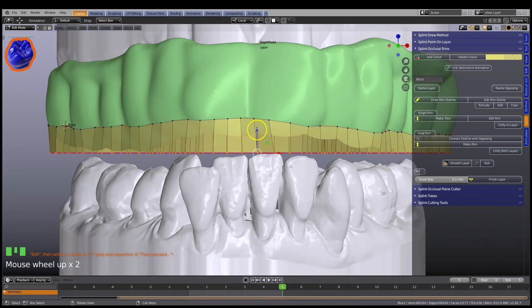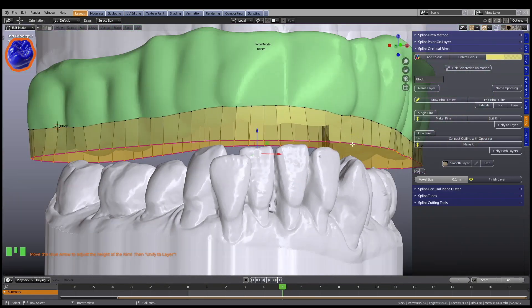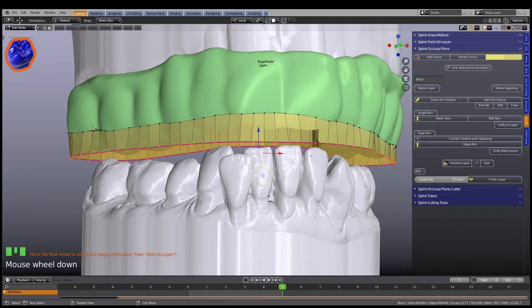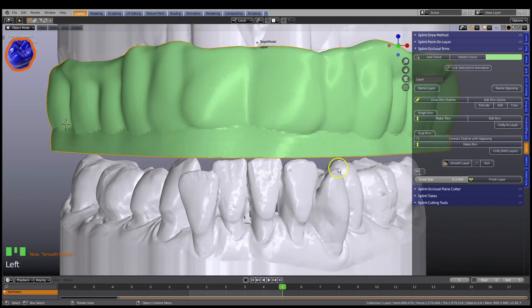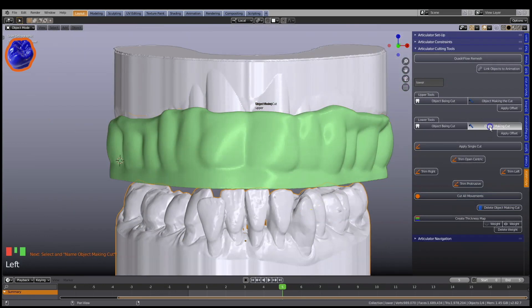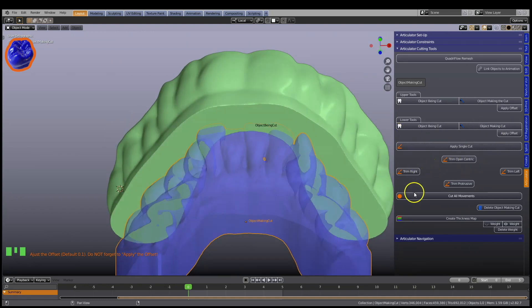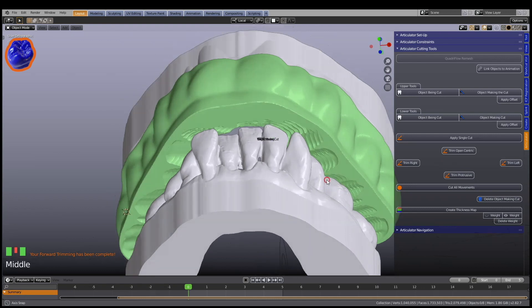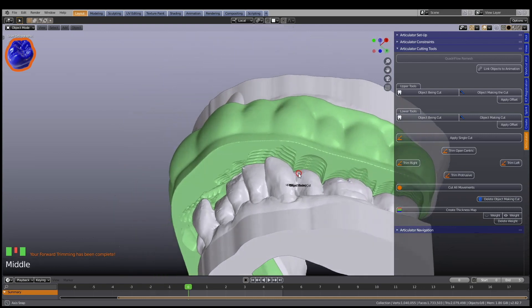Occlusal rims can easily be adjusted to the correct height, or they can be adjusted at a later stage. The articulator cutting tools are then used to adjust the occlusion according to Blender's animation timeline.